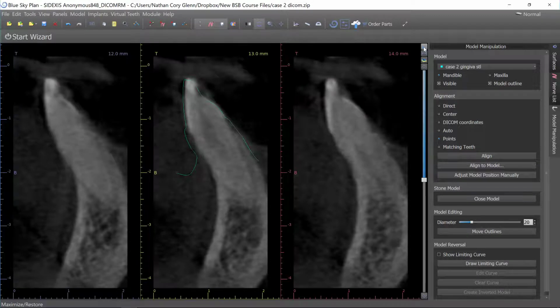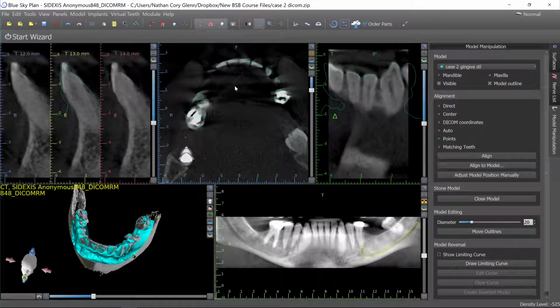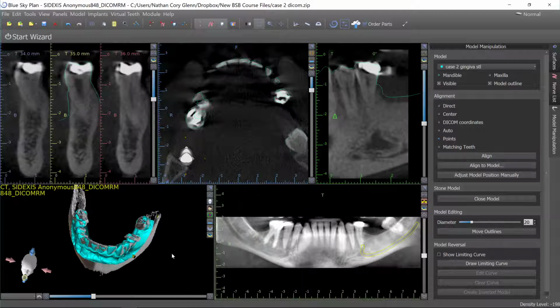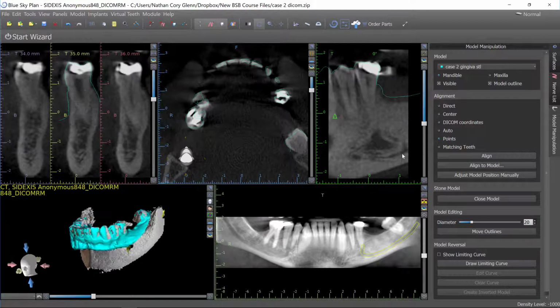I find this happens most often right at the midline where the tube head is circling their head and then they get hit in the back of the shoulders, and then oftentimes as soon as it passes they're back in position. So in this case, I've done this enough that I trust the stitch that we've got, and so I'm going to go ahead and go with it.